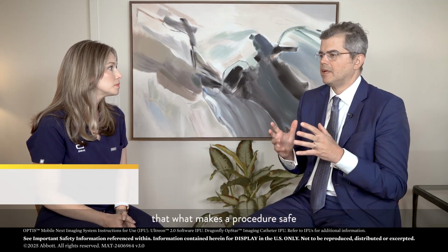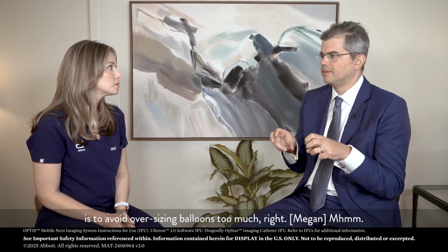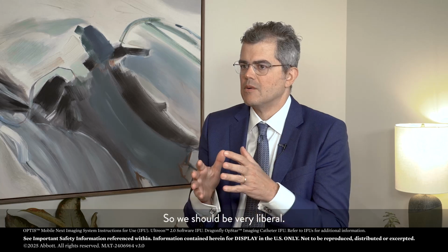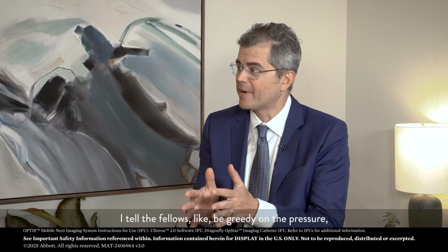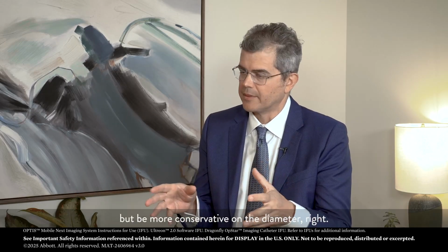I think keep in mind that what makes a procedure safe is to avoid oversizing balloons too much, right? So we should be very liberal. I tell the fellows, be greedy on the pressure, but be more conservative on the diameter, right?